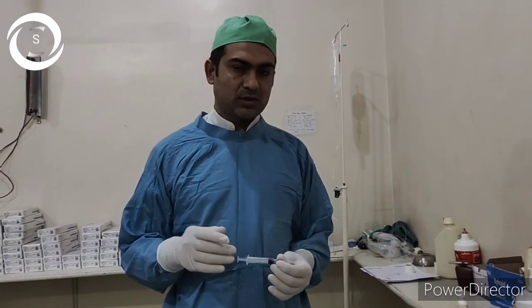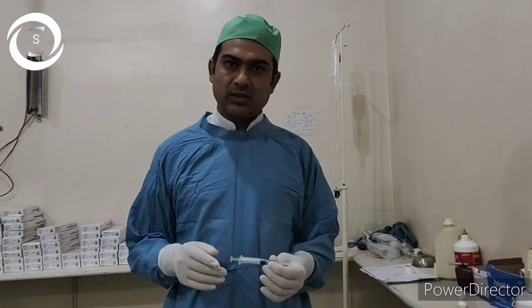Now in this challenging case, I showed you how to inject intravitreal anti-VEGF or any injection. Now at the end of this video you will be able to know what are the steps of intravitreal injections into the eye, how to avoid endophthalmitis while performing intravitreal injections into the eye, and what are the complications common and rare while performing intravitreal injections, and how to make diluted povidone iodine for intravitreal injections.